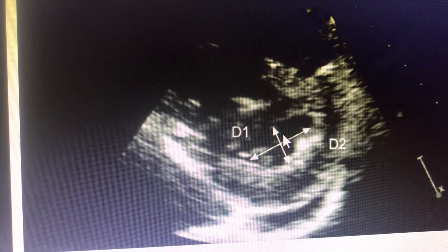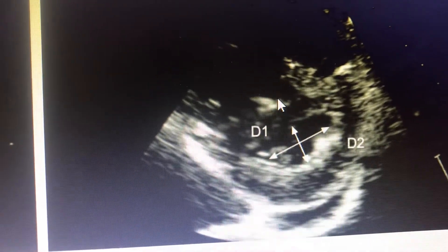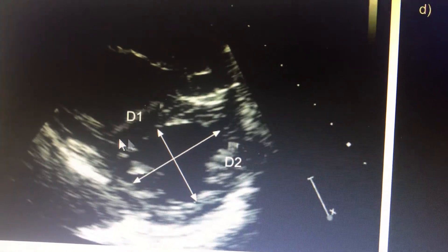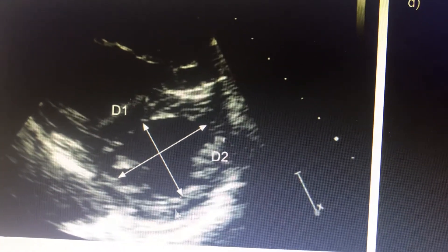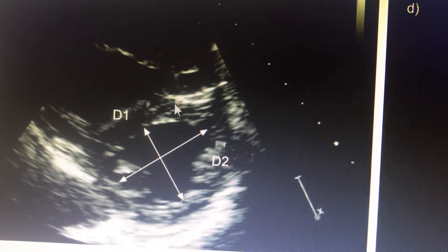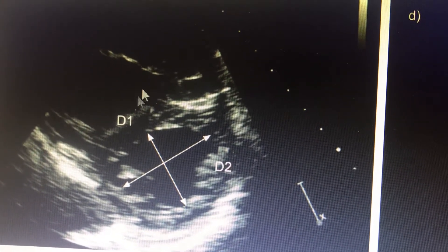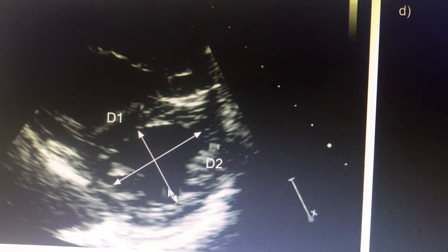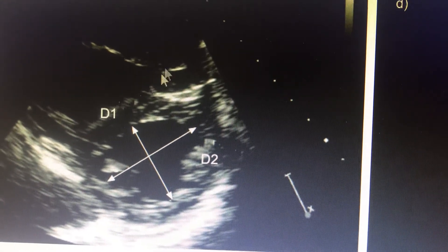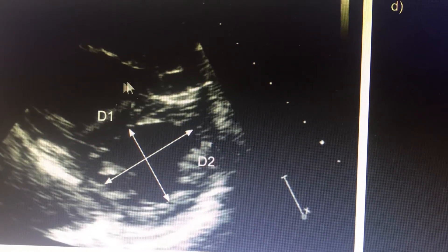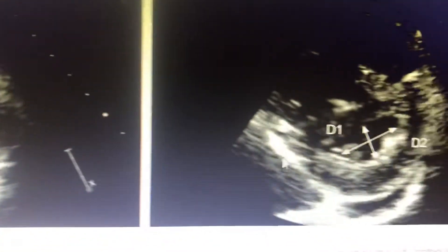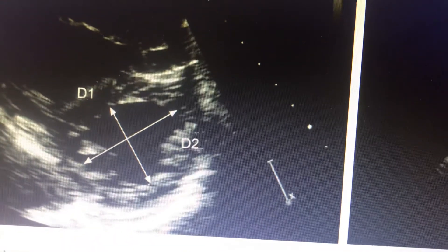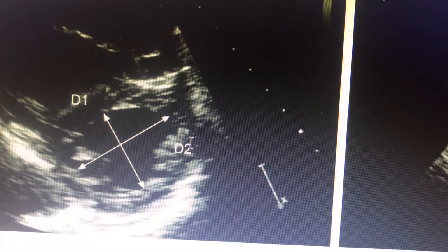The LV Eccentricity Index becomes greater in end systole in RV pressure overload situations. Whereas in RV volume overload situations, in end diastole the septum gets deviated towards the LV, and an end-diastolic LV Eccentricity Index more than 1.6 indicates severe RV overload, while more than 1 correlates with significant RV volume overload. To summarize: end-systolic LV Eccentricity Index greater than 1 correlates with RV pressure overload, and end-diastolic LV Eccentricity Index greater than 1 or 1.2 correlates with RV volume overload.